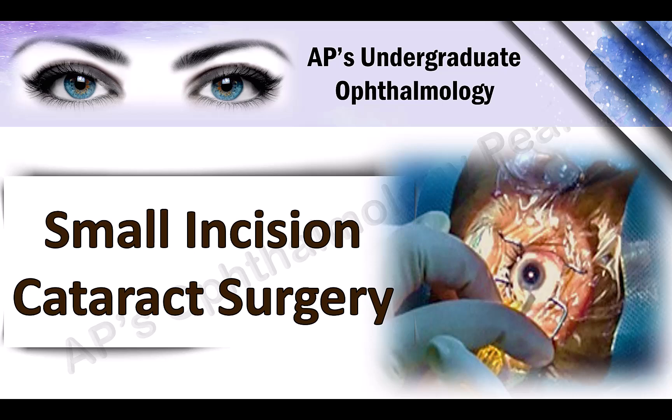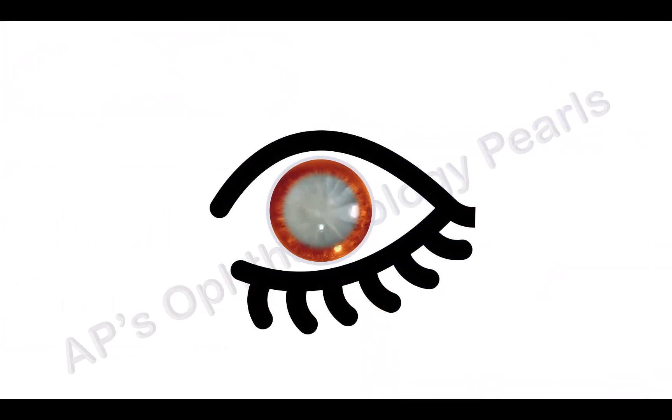Today we shall talk about the basic procedure of SICS, or Manual Small Incision Cataract Surgery, for easy understanding. The surgical technique will be demonstrated with respect to the right eye.